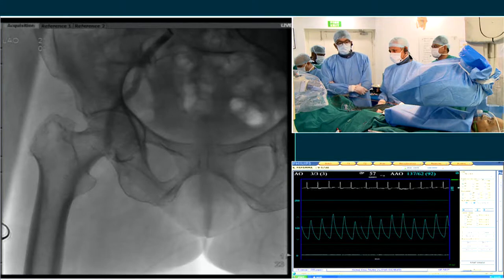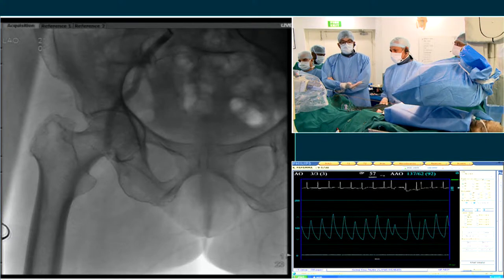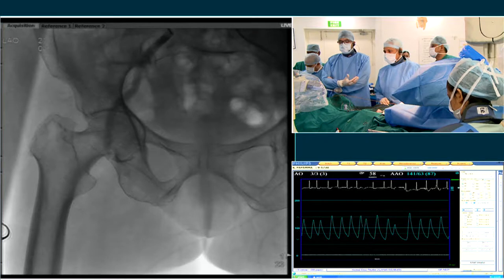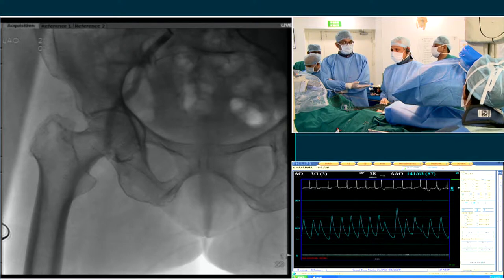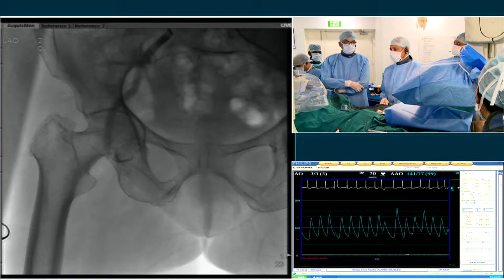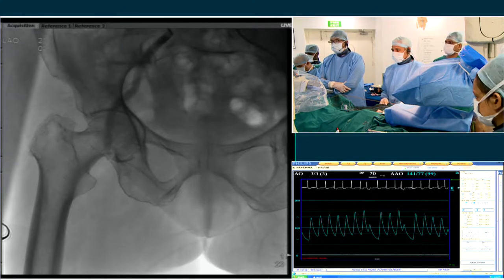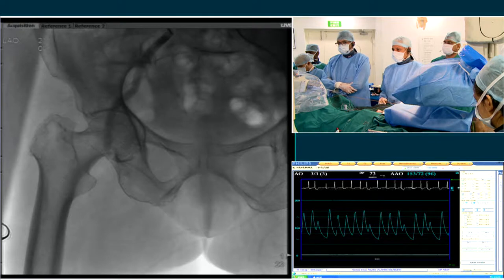The scenarios are, we had a case with a right non-fusion and a short mobile left coronary cusp. As we deployed the valve, it was displaced toward the left coronary. Although the sinuses were big, the entire valve was displaced and it occluded the left coronary because that short leaflet was pushed over that way. In this case, it's going to be displaced towards the non-coronary, if anything, and there's no issue of coronary obstruction there. In one other case, we took a slightly lesser sized valve to avoid aortic annular rupture, because it doesn't expand on that side, it expands totally this side. If we take a bigger valve, we could land in trouble.